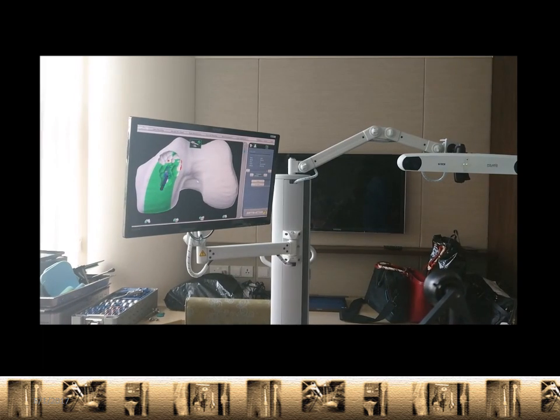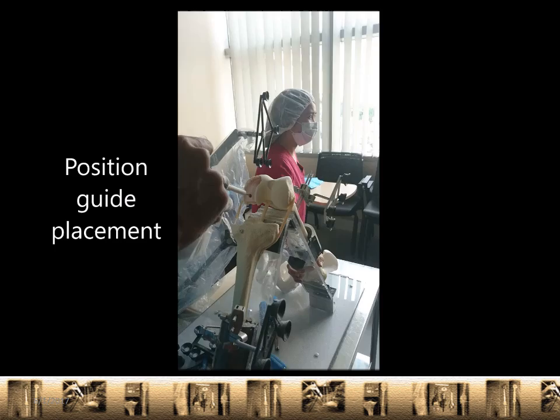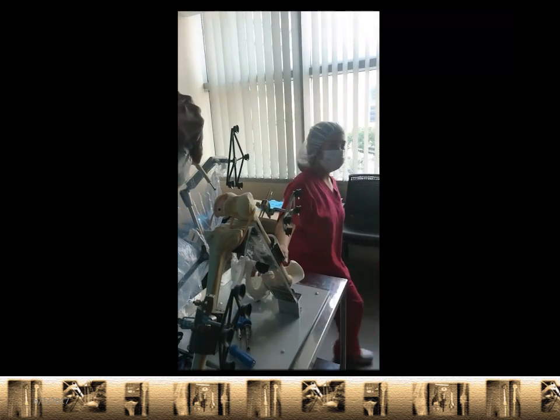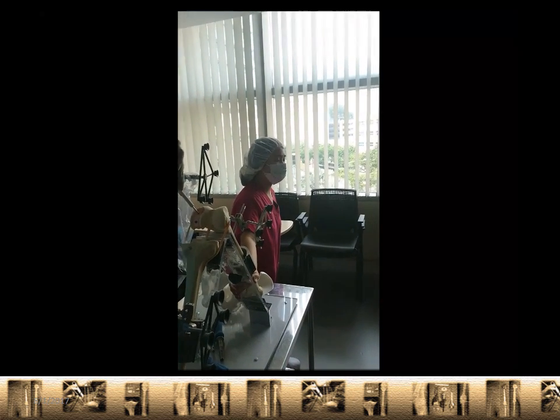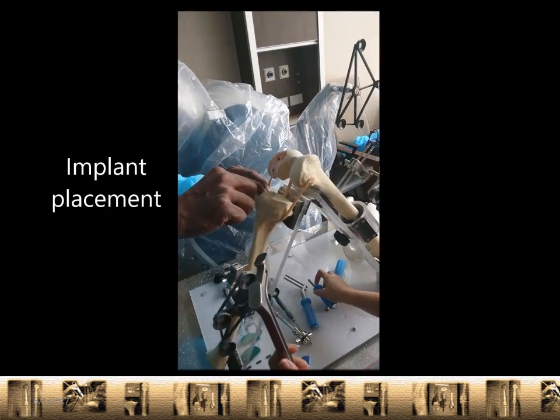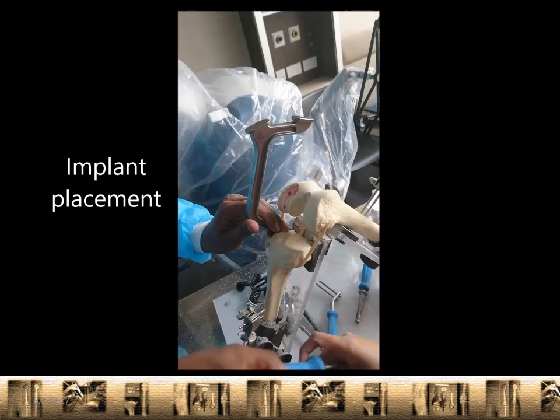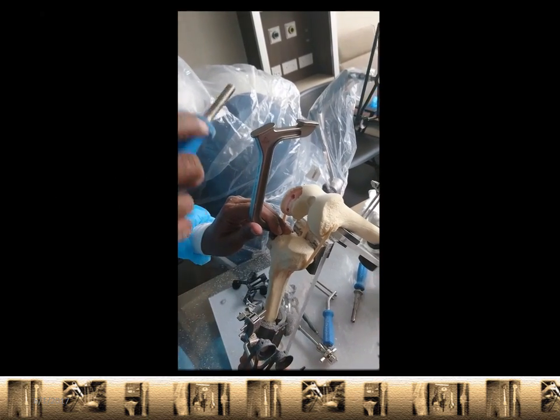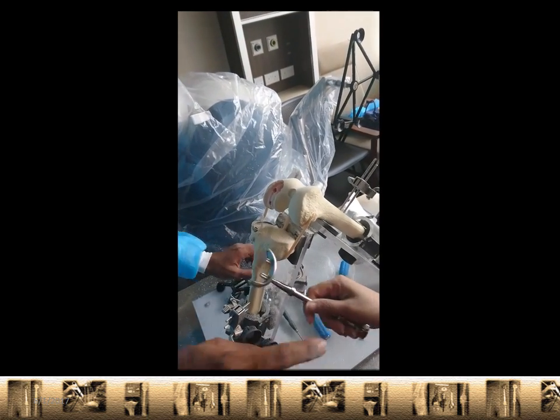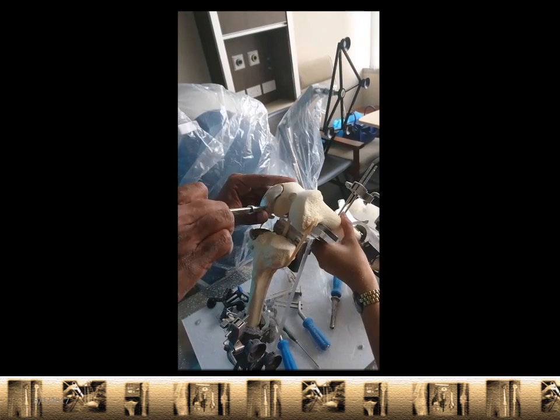And once again, there are no big cuts here — it's really just shaving off the bits. And then we put in little positioning holes that will hold the little stubs on the implant, and that is always monitored by the computer. And then we place the implants in the area. This is all done on the saw bone, so it's all done very quickly. But essentially, these are the steps that we use before actually doing one on a patient.